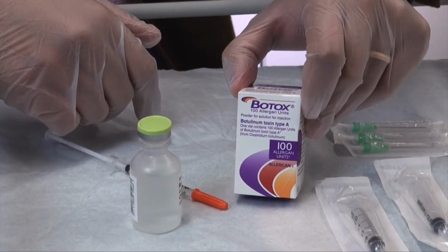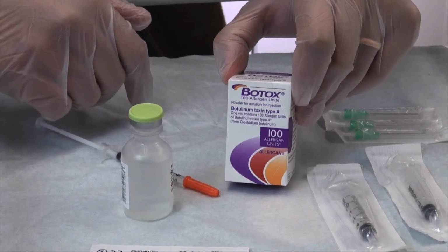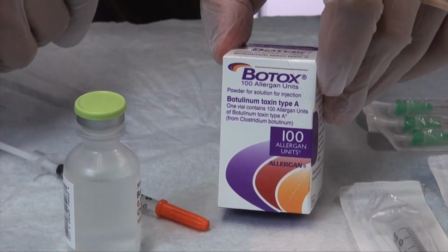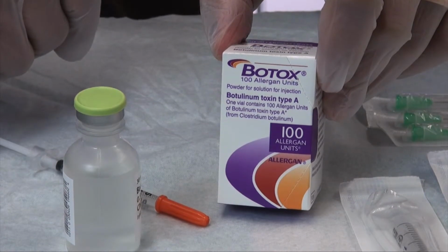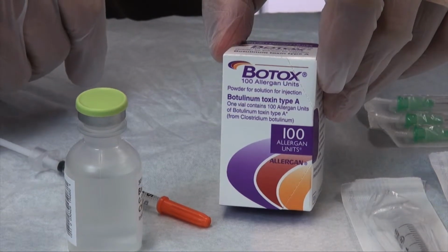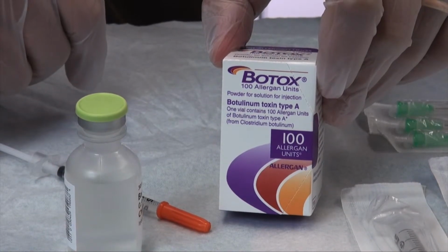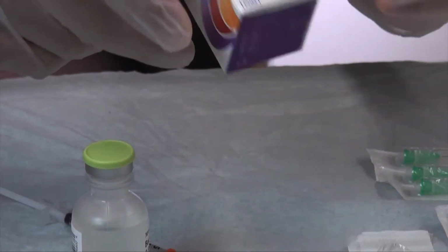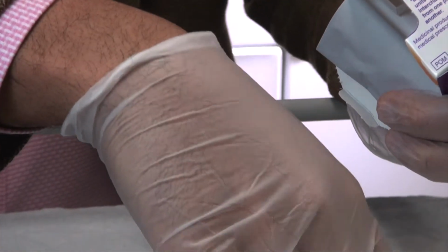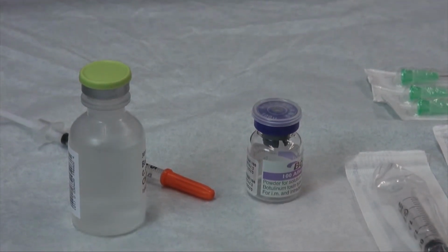So here we have Allergan's toxin, Botox, as I'm sure most of you are familiar with. It contains 100 units of the actual toxin itself. It does actually come in a smaller 50-unit format, but in our clinic we always order it in the 100-unit format. I'm going to open the box to show you the appearance of the actual vial itself. Here we go. We have the 100-unit toxin vial.